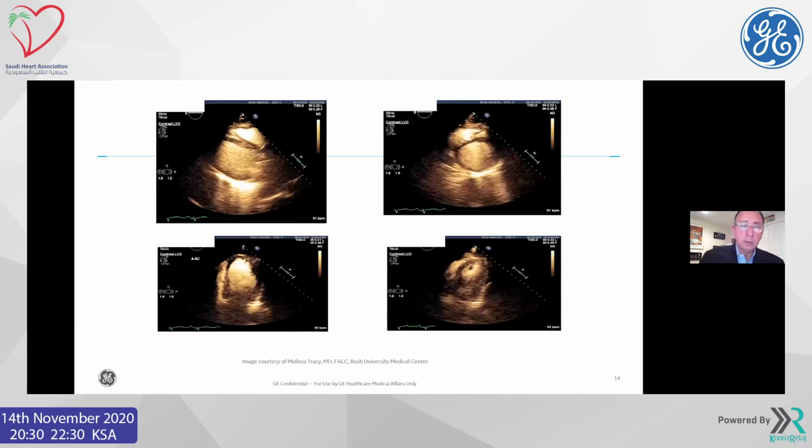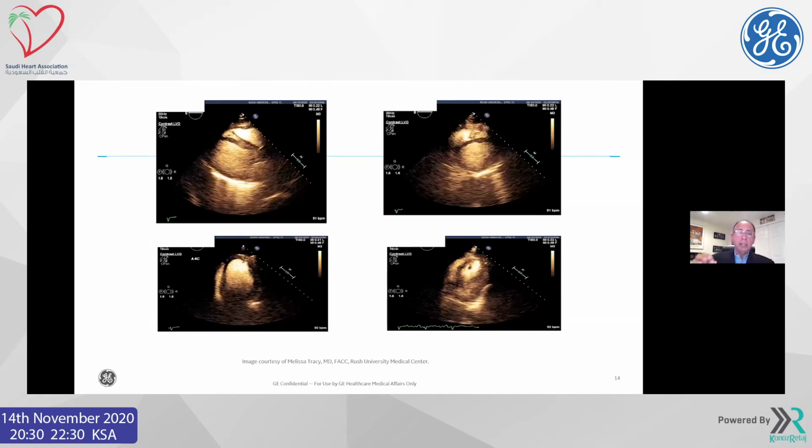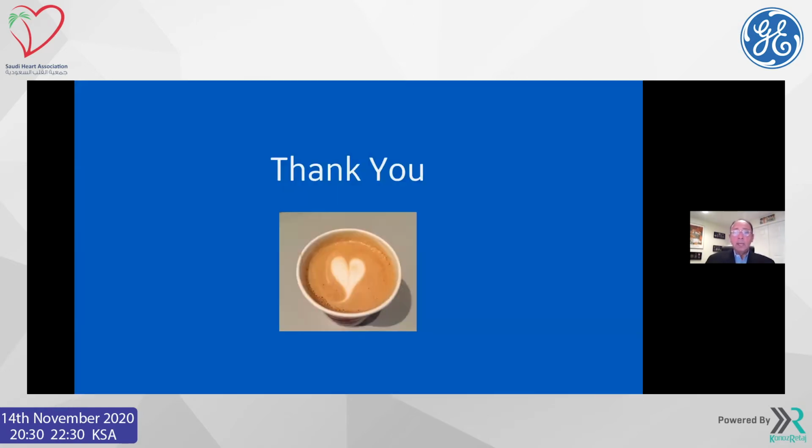If you're using it for transesophageal, make sure you inject very slowly, because otherwise a fast infusion is going to, again, attenuate, and then you have to sit there. We don't want to sit down the patient's throat any more than we have to, right? So a slow injection is important, especially if you're doing Watchman procedures and you're looking for thrombus or clots in the left atrial appendage.